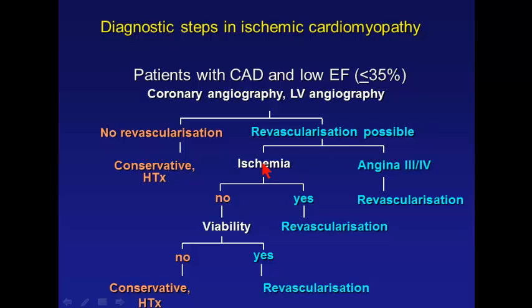In my country, we have done a lot of research on PET perfusion, but it's not yet reimbursed, because the officials and the authorities usually have not a lot of knowledge about medicine, so they think, okay, we do a little bit of administration, and then they say, well, PET is new and is a bit more expensive, and to cut the story short, it's not reimbursed, so we're not doing a lot. SPECT has a very broad database. We know a lot about it, and it's the most widely used test. Maybe it will be replaced by PET, we don't know.